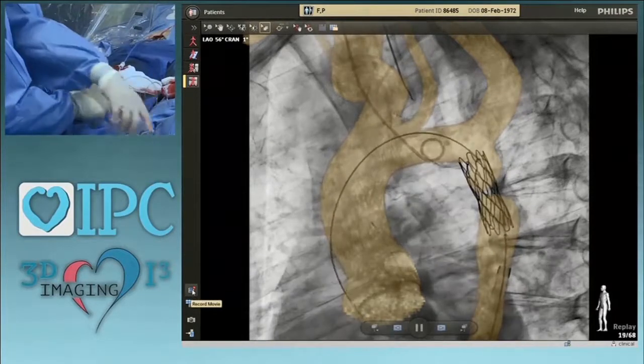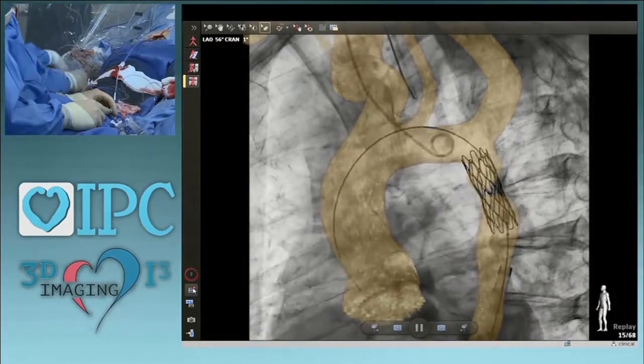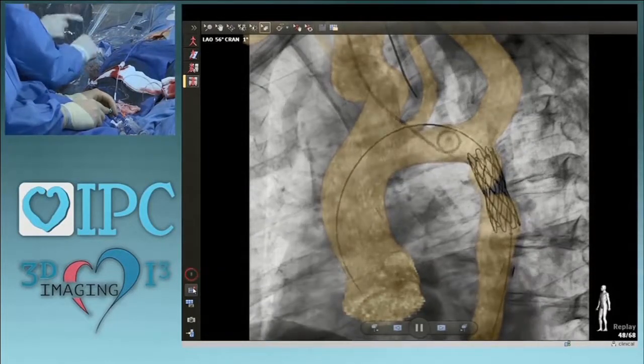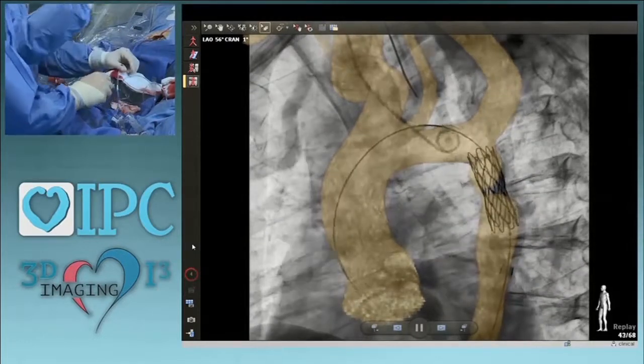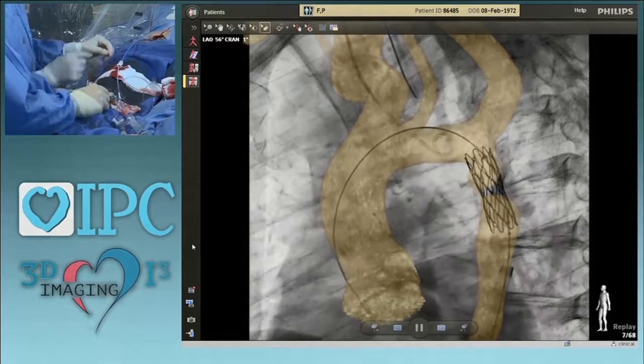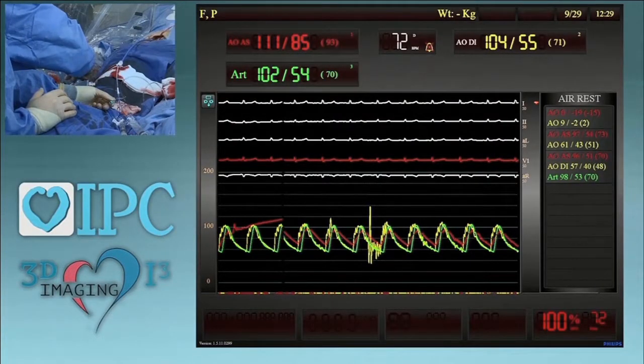We are going to give you pressures. Do you want me to come back with this balloon? You see the pressure there. Yes, both. There is some contrast inside. Okay. So you may see the pressures. Please take a look. Can you see the recording, the pressure recordings?